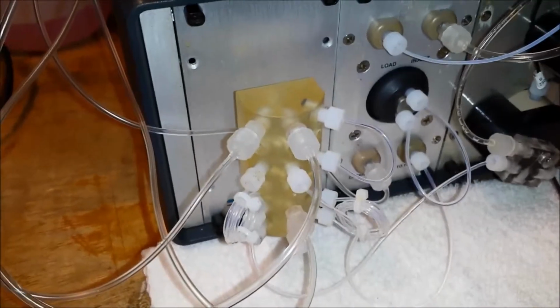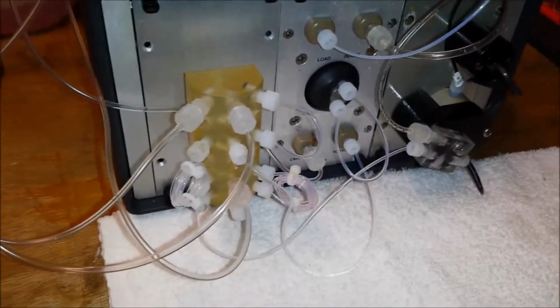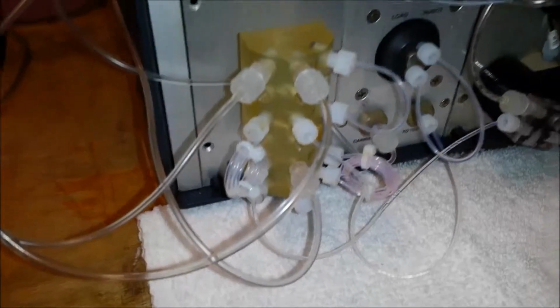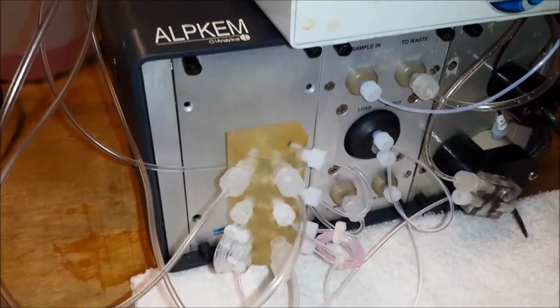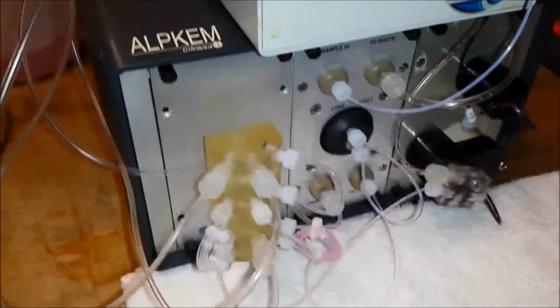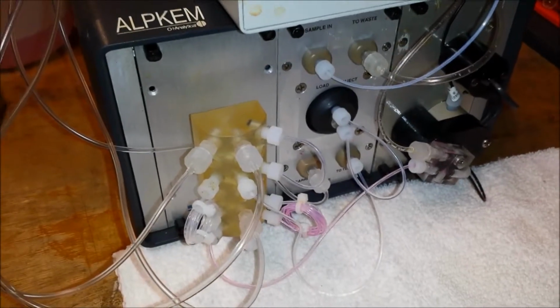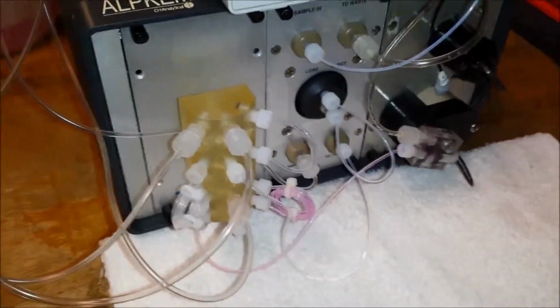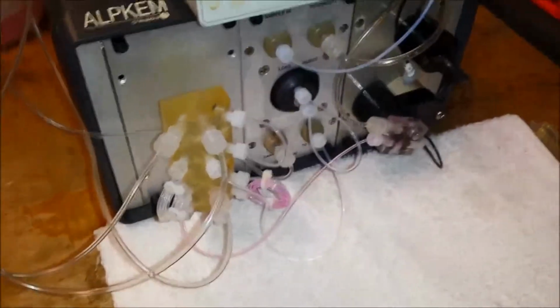is tearing the lamp apart, tearing the photodiode apart, tearing the flow cell apart when the problem is reagent, or vice versa, changing reagents, changing the water, changing other aspects of the chemistry when the problem is actually the flow cell, the lamp, or the photodiode. You always want to make sure you're going in the right direction so that you solve the problem quickly and don't cause new problems in the process without solving the actual issue.